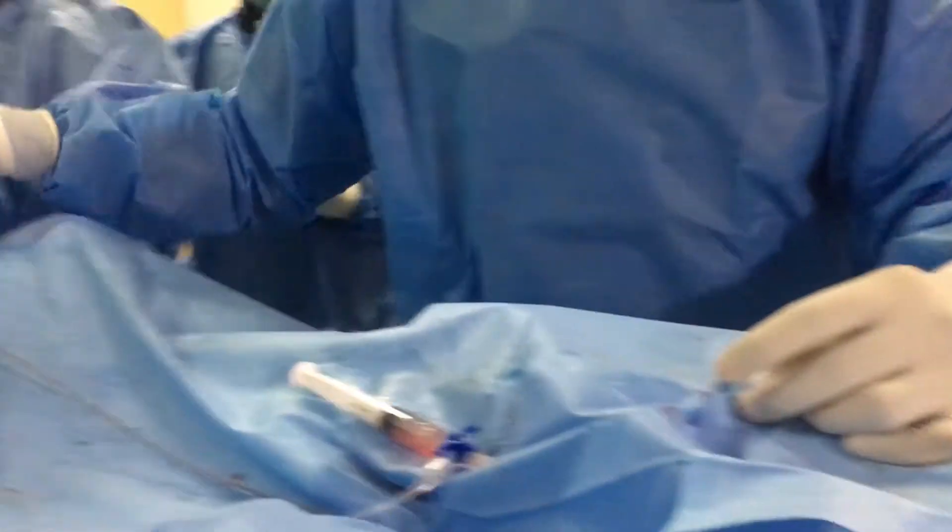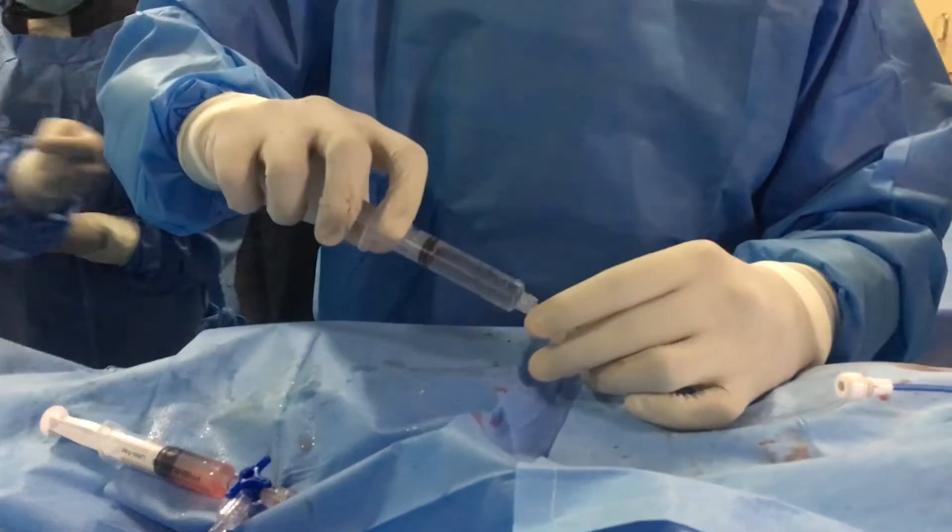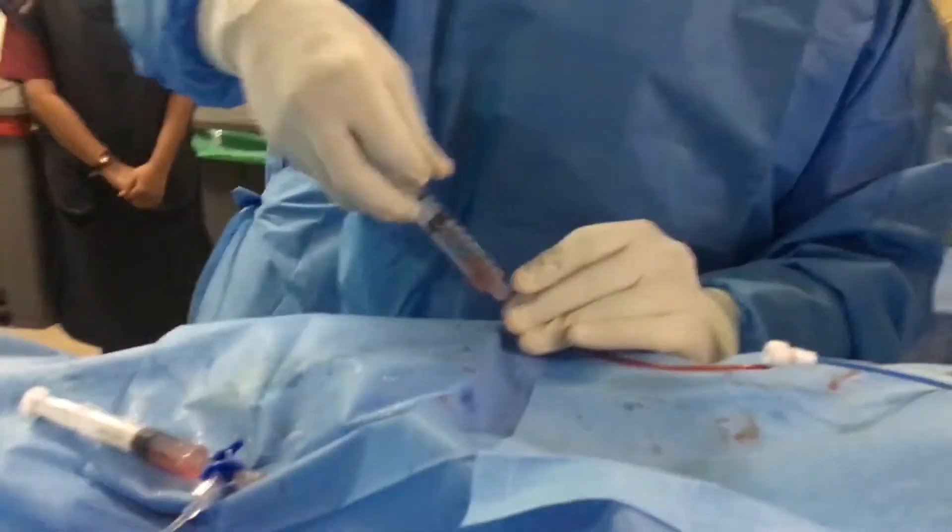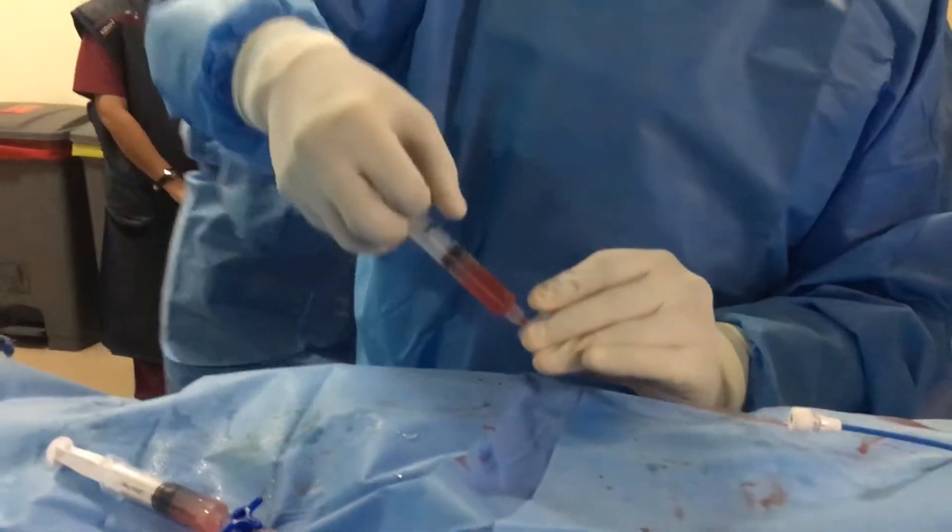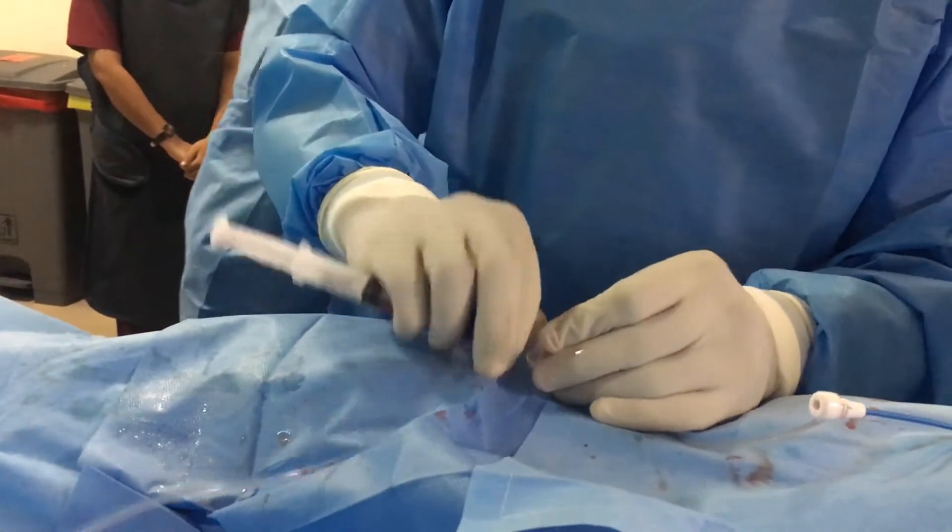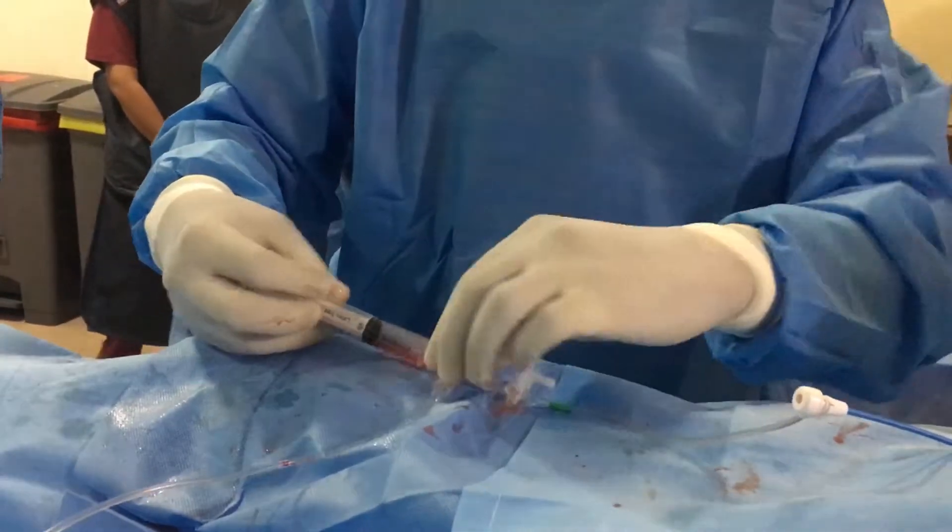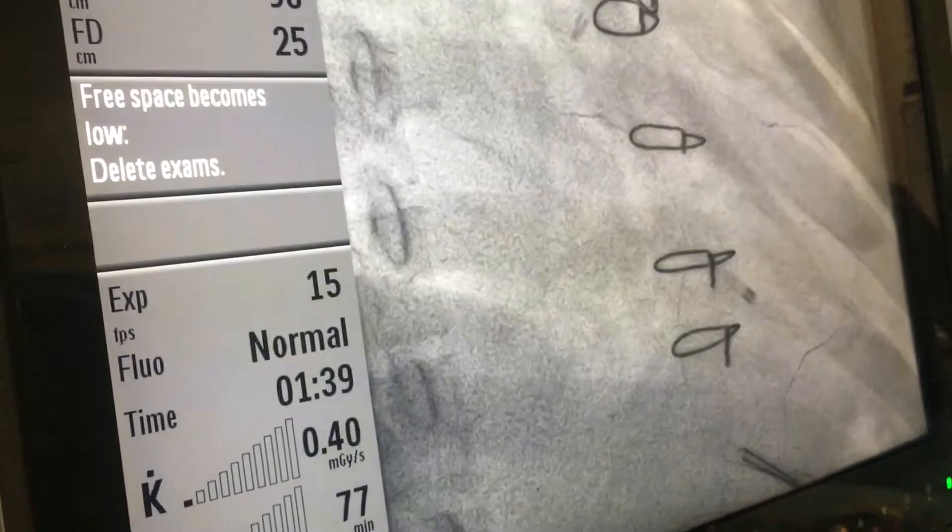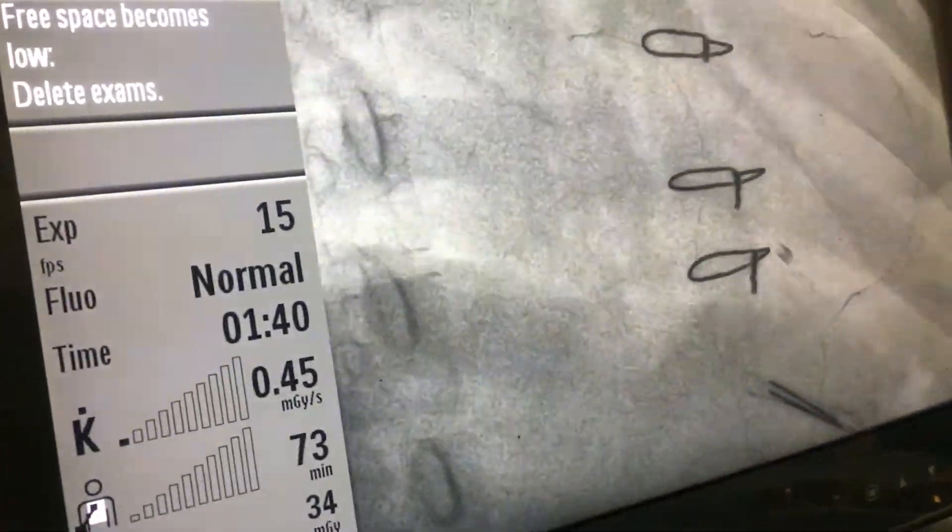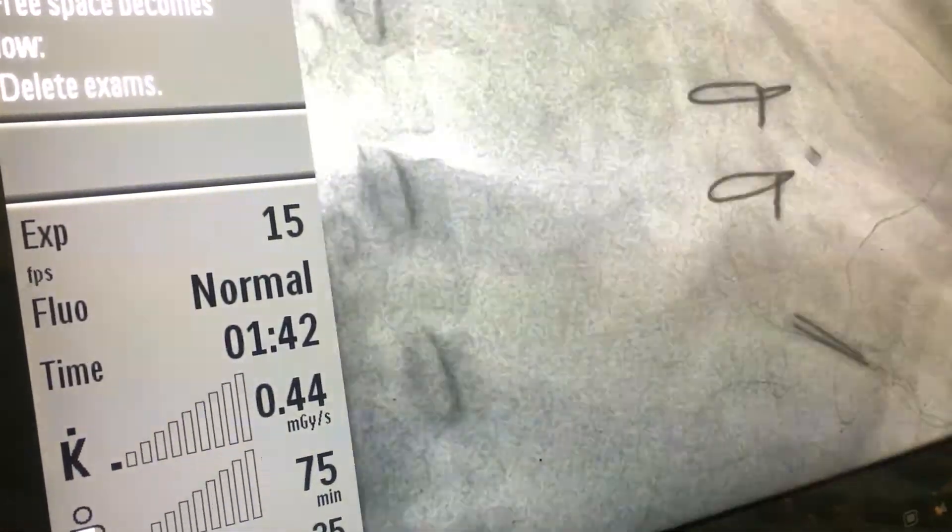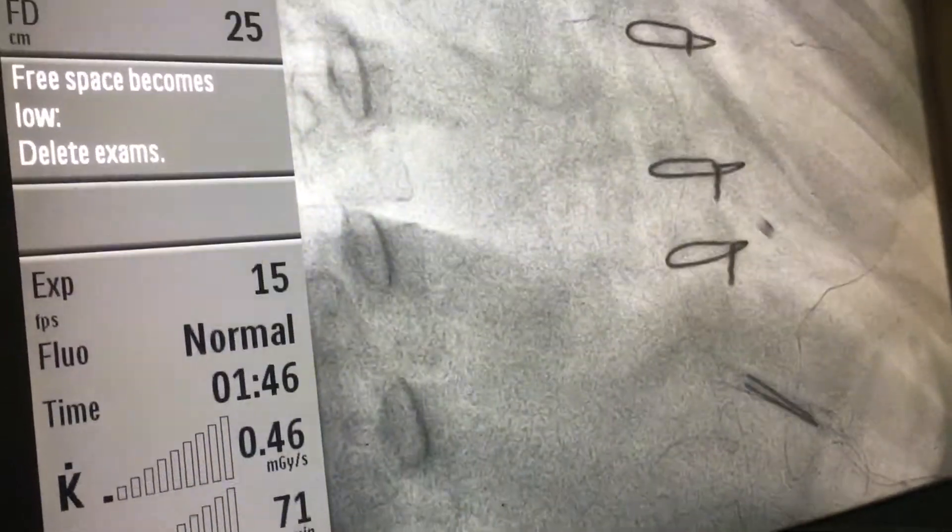Okay, so now I'm going to re-edit. Okay, fine. So we are in the RV. Yeah, so you can see the fluoro. So it's a post-transplant patient. We're going to take RV endomyocardial biopsy. So our Mullein sheath is in RV. There's a view which is showing that it's close to the apex somewhere in RV.